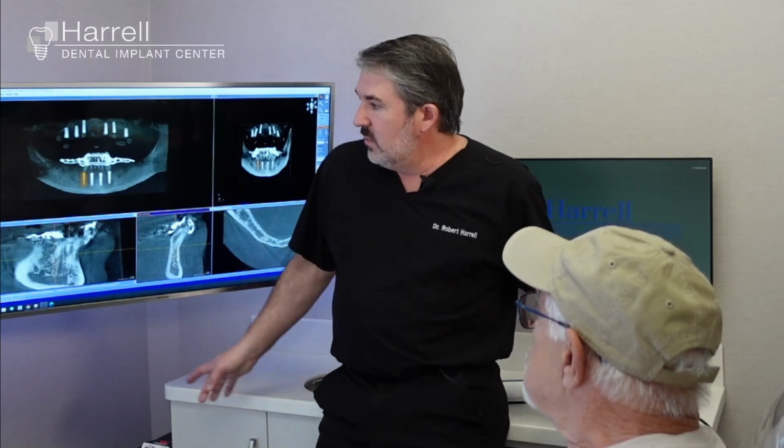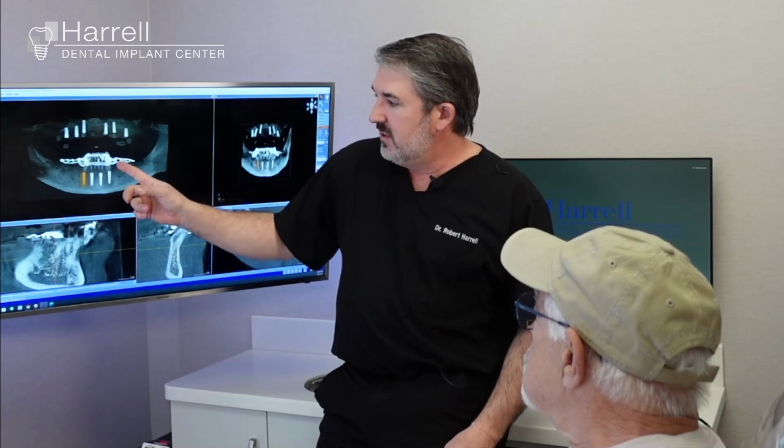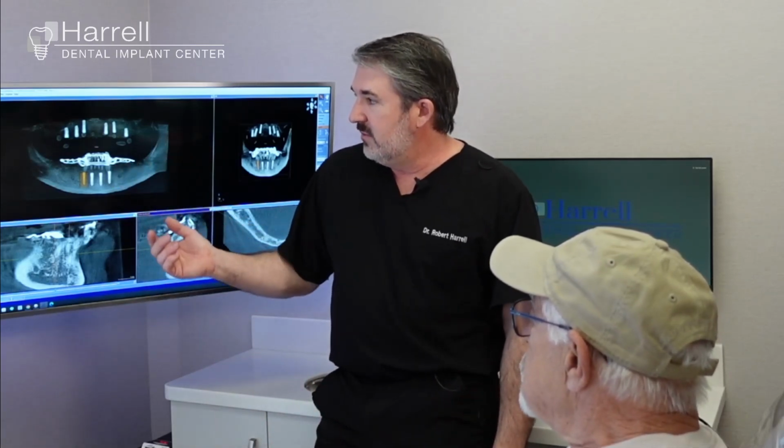All right. So we've got you set up for a double All-on-4. Based on what I've got on my plan here on your CT scan, I'm looking at probably 6 implants up top, at least 4 on the bottom, maybe 5, maybe 6. When this procedure first started, they coined a phrase called All-on-4, which is what most people knew it to be. Now it's shifted a little bit. It's more of an All-on-X, because X is the variable, how many implants. So in your case, probably at least 10, maybe 12.